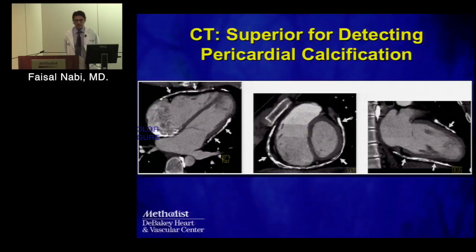And you would go for a CT also? I believe so, sir, yeah. And definitely, like you said, in conjunction with the echo, you know what's sitting there and you can figure it all out. And personally, as the talk develops, I hope you'll agree with me, I think we are underusing some of these techniques to help us make the diagnosis of pericardial disease. We deal with large patient populations who have had extensive surgeries in the past. These are the patients who develop these diseases.